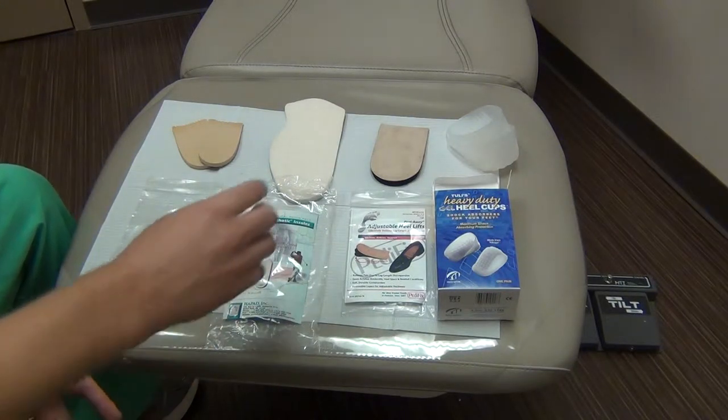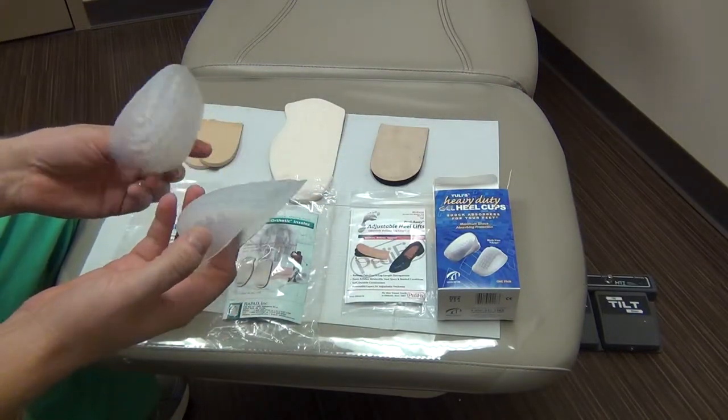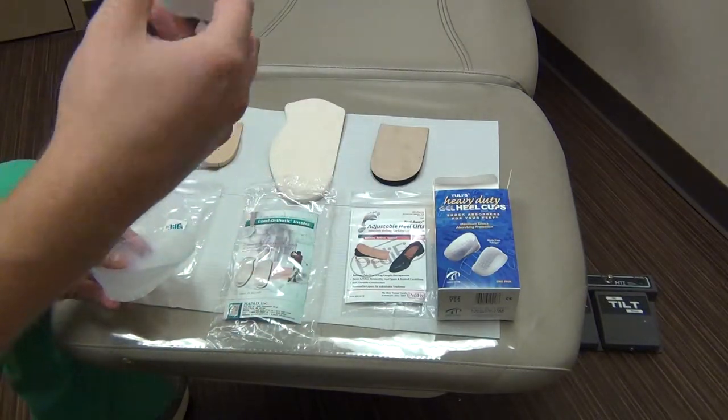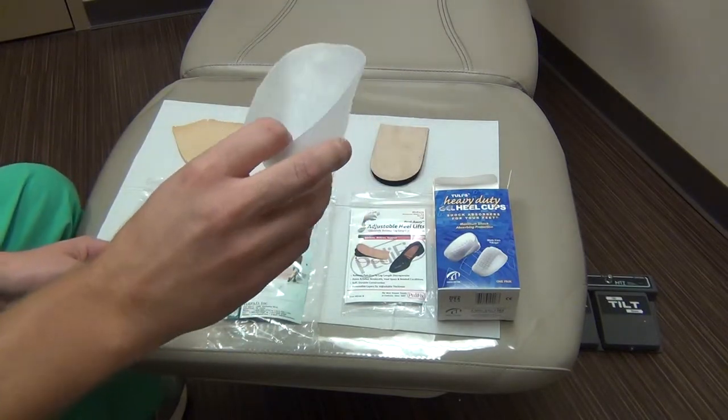The most common one that you'll typically see is this one here. This is called the Tuli's Heavy Duty Gel Heel Cups. These are most commonly used for patients that are suffering from pain, especially kids suffering from heel pain from disorders like Sever's disease, which is actually a growth plate discomfort that children can get.